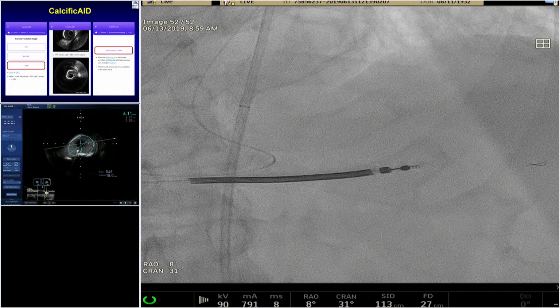So most of the wire is here. We now call this by a new name, the anaconda. And this is the drip. If you want to activate the Dyna, you press this button. When the Dyna is on, even if you try to activate the burr, it will never activate. So you go off Dyna, and now you can check your speed. It's 152, so we are ready to go. We are activating the Dyna again. The clip is on, so we are just going to go in.